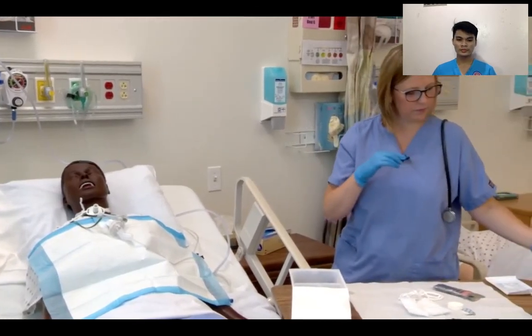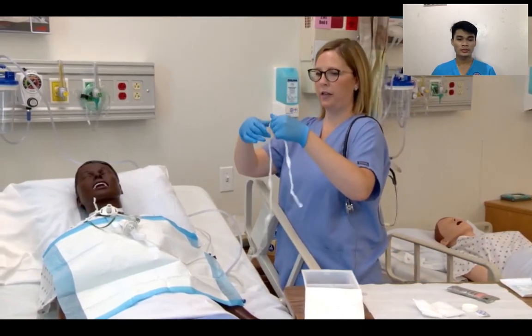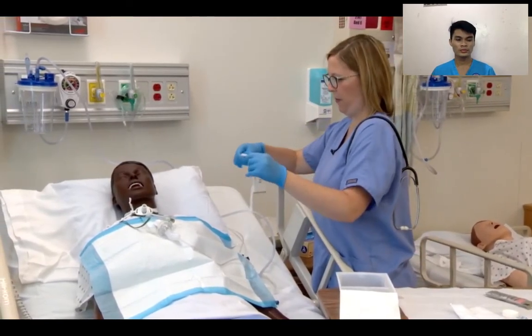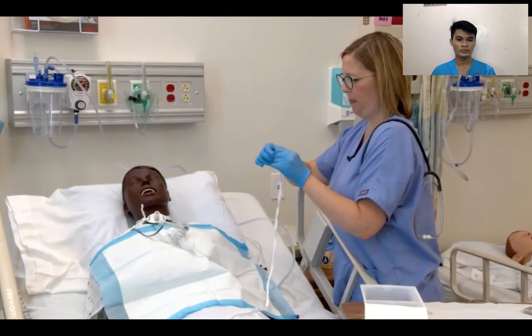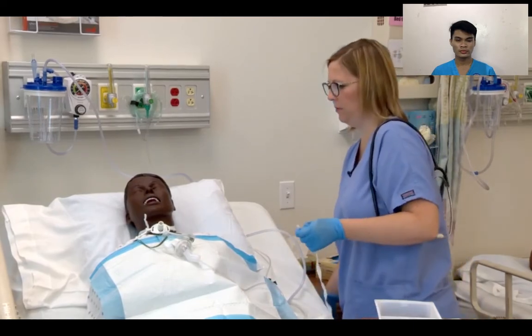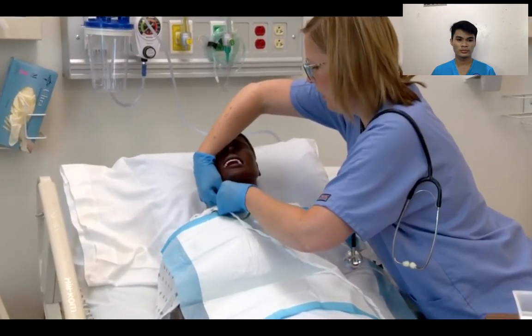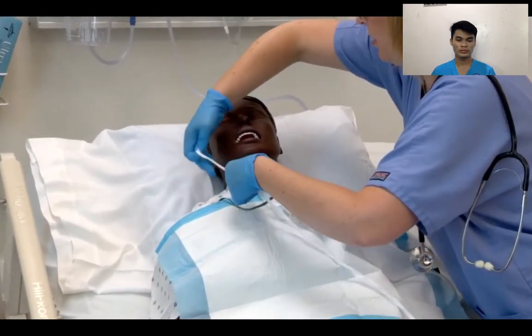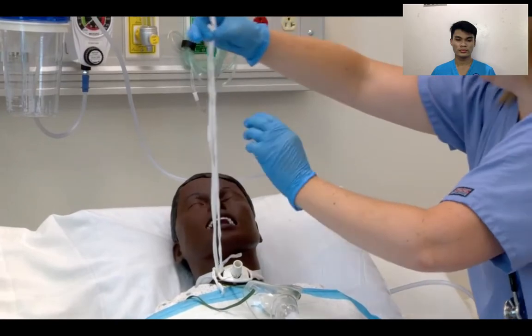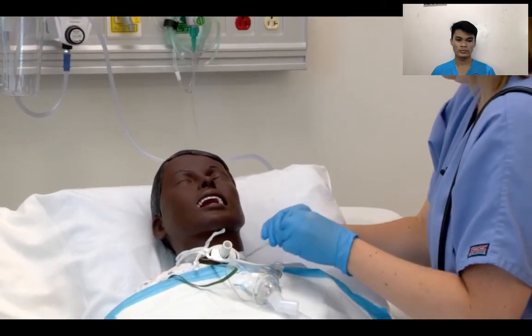Going to change the trach ties. Now this is where it's nice to have a partner, but if not, it can be done individually. Take the tie now. Here, get this around your neck. Okay?